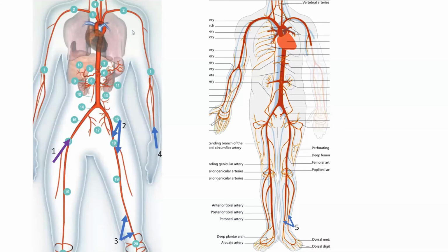Radial can be used as a standalone access for iliac and SFA disease, including complex SFA and iliac CTO, but not very complex. So you can use it for SFA CTO as long as it's not very heavily calcified SFA CTO, because then you use a lot of support and pushability. And so it may not work in those cases, although you can do combined radial tibial strategy in those cases. But anyway, so radial can be used as a standalone strategy. It can be used as a supportive strategy for CART in SFA and iliac technique, especially in iliac technique. You can use it as an antegrade access and retrograde femoral access to do CART in complex recanalization. But keep in mind, it can be used as a standalone revascularization access, and we're using it more and more.